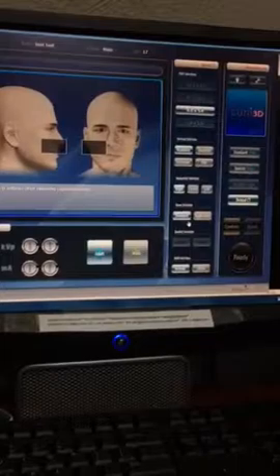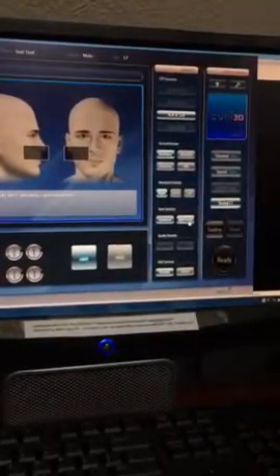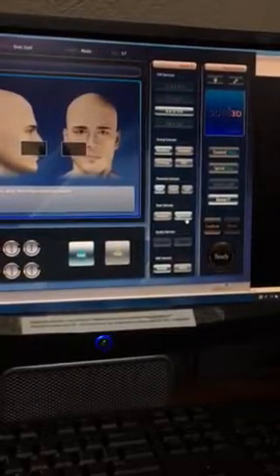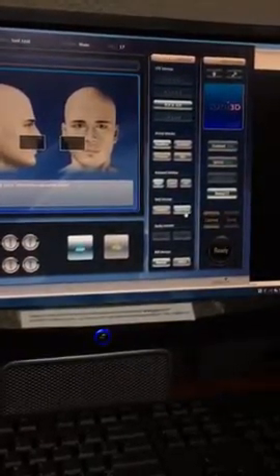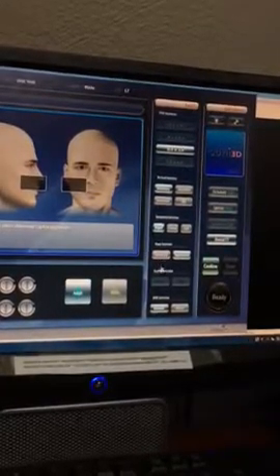I'll leave it up to the doctor or the end user. I always prefer to use the application mode because the image quality in my estimation is perfectly good, and especially in a training situation it goes much faster. If anybody has further questions or wants more information on exactly what happens between these two selections, I'll be happy to provide that data. Normal and metal: AMAR is metal artifact reduction.